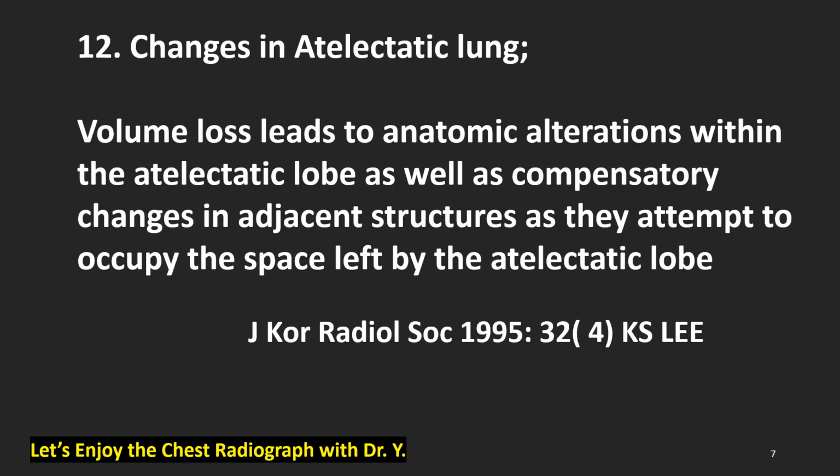Changes in atelectatic lung. Volume loss leads to anatomic alterations within the atelectatic lobe, as well as compensatory changes in adjacent structures as they attempt to occupy the space left by the atelectatic lobe. K.S. Lee.